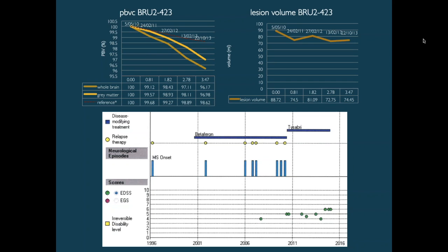And when we look at the left part of the slide, we see that this patient has a considerably higher rate of atrophy. And this confirms a bit my clinical suspicions in this patient, because the previous patient, my clinical feeling there is that we're doing okay. In this patient, I have the feeling that we're not doing okay, and that this patient is actually not really heading for a good place.